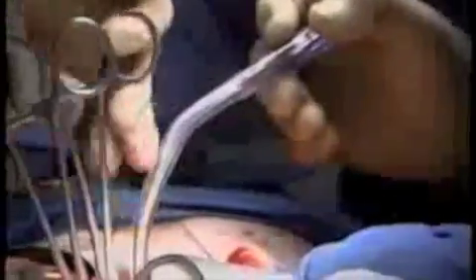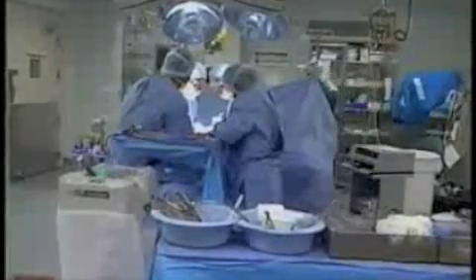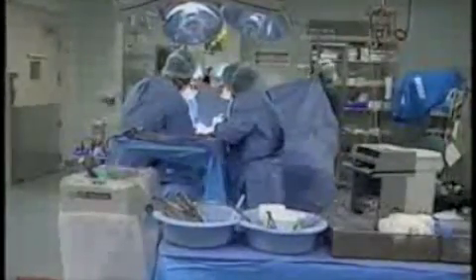Effective device design will allow a clinician to use a device correctly the very first time without the need for training or referring to manuals. Clinicians will, however, become more effective at using the device with additional training or experience. One of the issues with surgical devices is that many of them are designed in a way that it's more difficult for the surgeon to do what they want to do because of awkward hand positions, awkward body positions, and this can sometimes be frustrating and even affect the quality of the surgical repair.